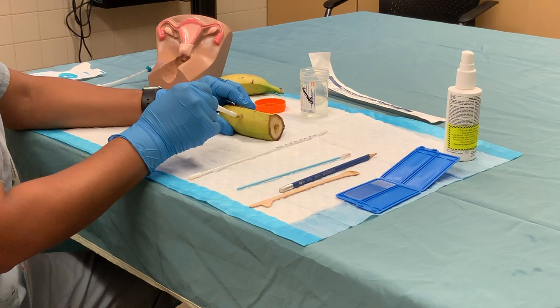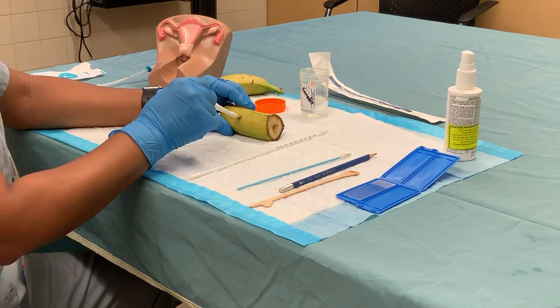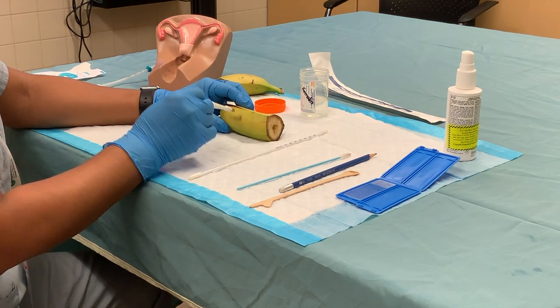you will apply the vulvar biopsy at a 90-degree angle like this, holding it at its tip. Just be aware that the metal part has a blade on the end, so be careful not to touch it or you will cut yourself.